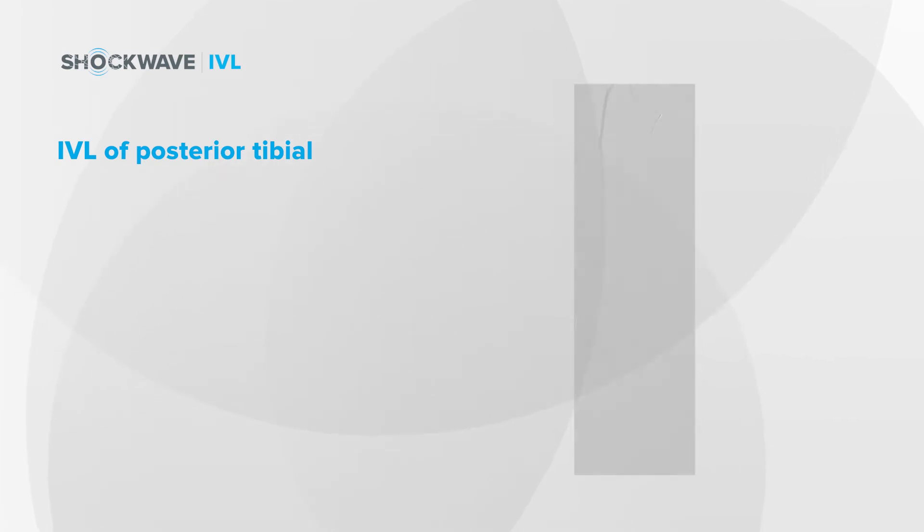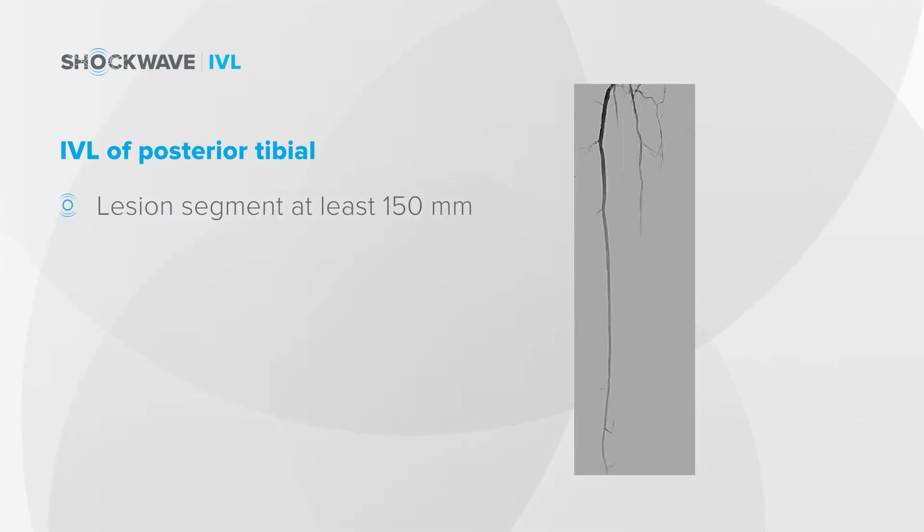After treating the anterior tibial, I felt that it was necessary clinically to treat the posterior tibial as well, given the patient's significant disease. You can see here that the posterior tibial is heavily calcified. There's a long segment of disease that extends from the proximal posterior tibial to the more distal vessel — this lesion segment is at least 150 millimeters.